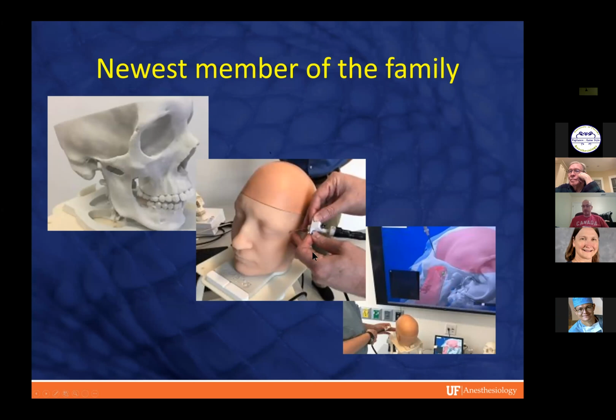So it's able to track this needle. It can tell us if we poke the needle in here, you can run into the bone with the needle. You can feel that physically. The computer is also capable of telling you which bone did you hit. The soft tissue, the muscles and the nervous structures of interest are also all in there. So the computer can tell you, did you actually end up putting the needle in the correct place? And whether you're in the right place or not, how far were you from a perfect position?